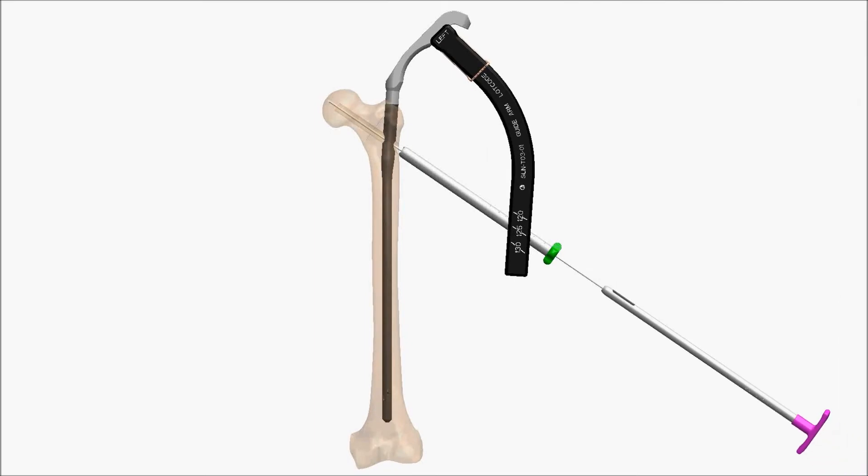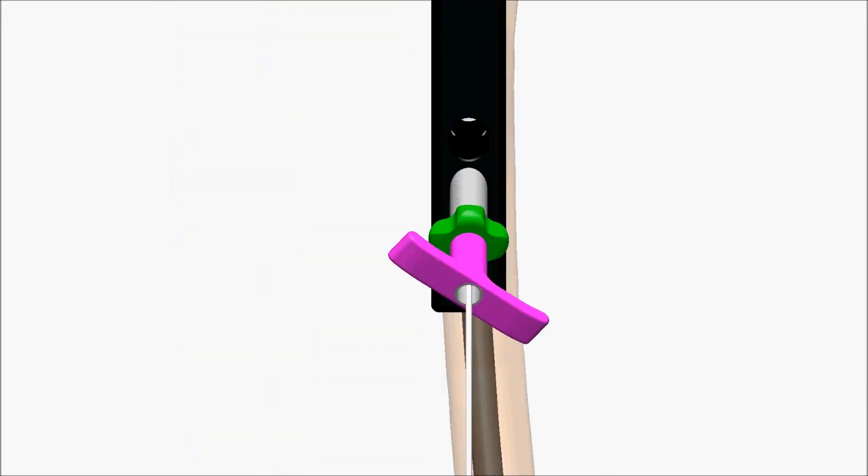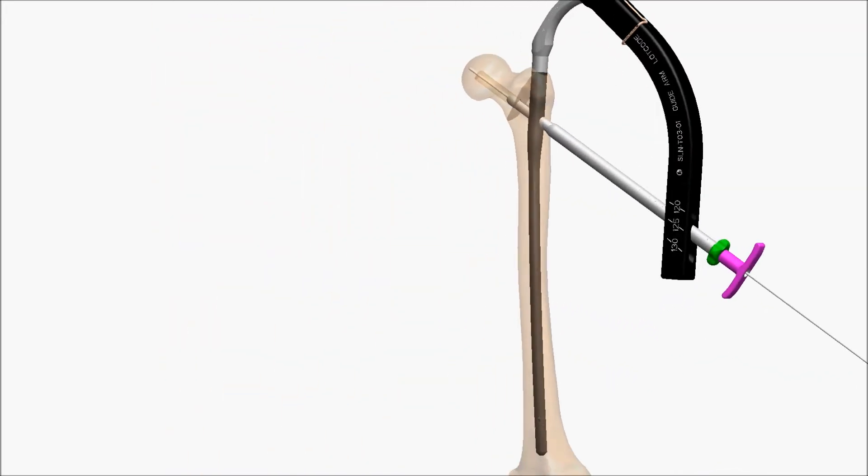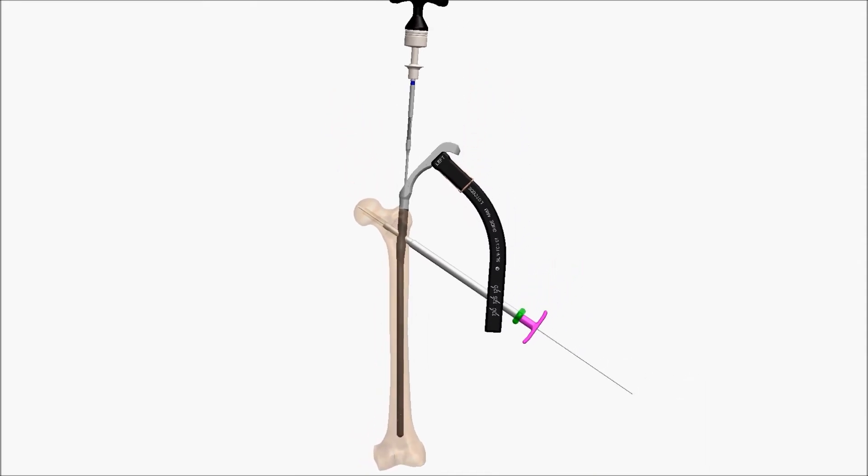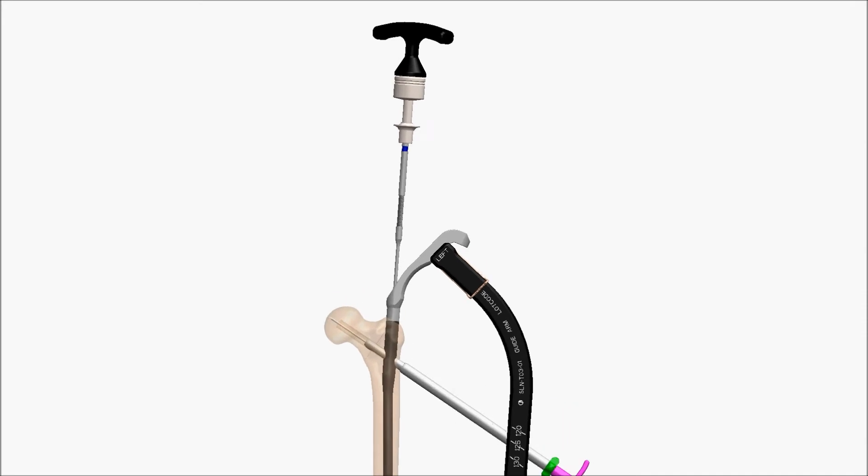Insert the lag alignment plug. The T-handle should be parallel to the guide arm. Pass the nail talon driver connected to the torque limiting T-handle down the nail until it seats in the distal nail talon mechanism.